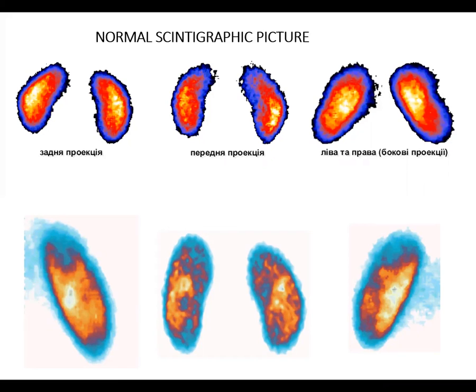Usually we observe such a picture in case of inflammatory kidney diseases like pyelonephritis, like glomerulonephritis, and so on. Damage of the renal function, not in case of such local processes like benign tumors, like cancer. In this case we don't observe such lesions.